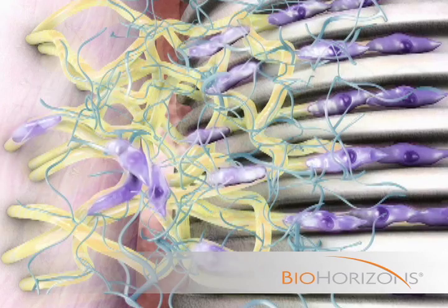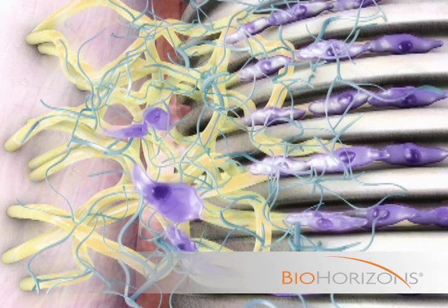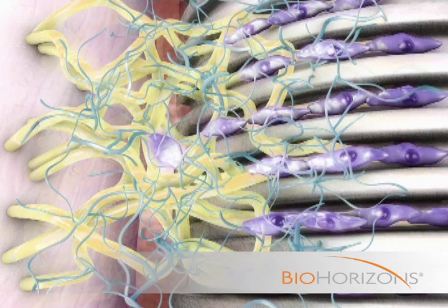The attachment establishes a protective soft tissue layer around the implant that protects the crestal bone from bacteria and trauma.